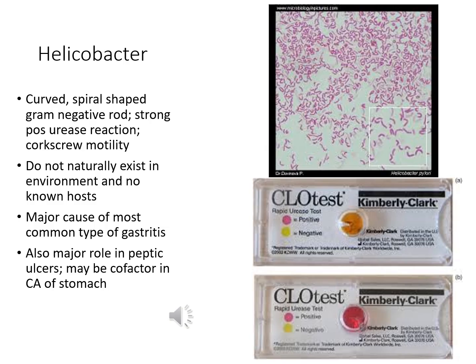of the stomach. So, since it's urease positive, oftentimes they'll actually just do a biopsy of the stomach and embed that into a urease agar and look for a color change. So a lot of times we won't actually get cultures for these, they'll just do the biopsy. If you look at that picture for the CLO test, you can see there, the little thing in the middle, that's where they would embed the biopsy piece and send it to the lab for us to read if it's positive or negative.